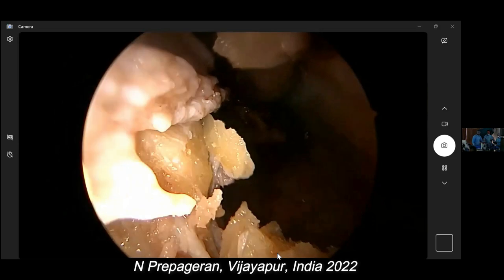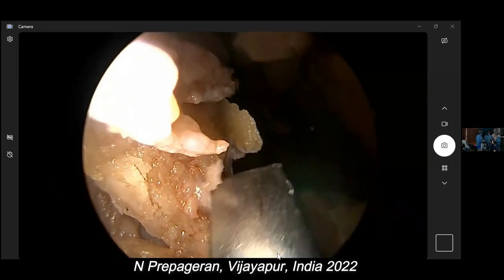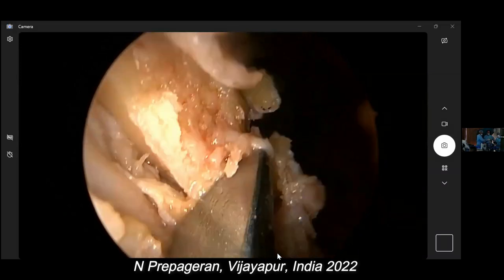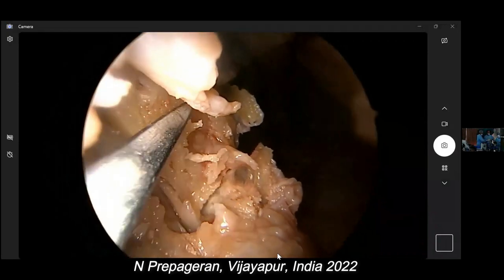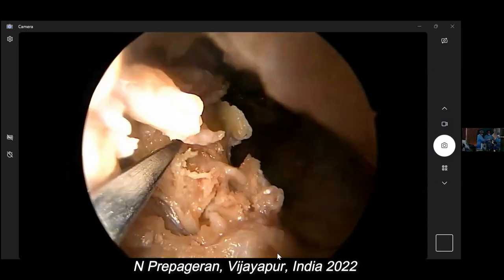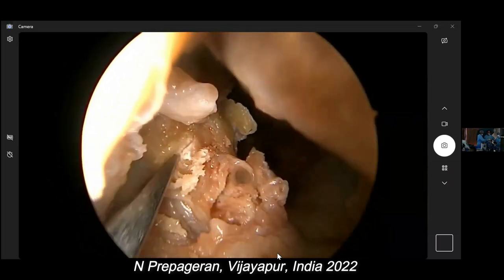He's 75 years old. Can you see that again? Yeah. So you see, we haven't gone through yet. Bang. Bang. So always listen to what your assistants say. They're usually right. Correct, Shashi? Yes. Bang. You see how hard the bone is for this gentleman?